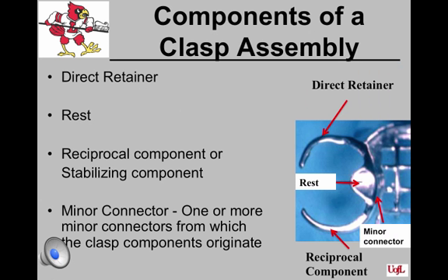To refresh your memory, the clasp assembly consists of the direct retainer, the rest, the reciprocal component or stabilizing component, and a minor connector.